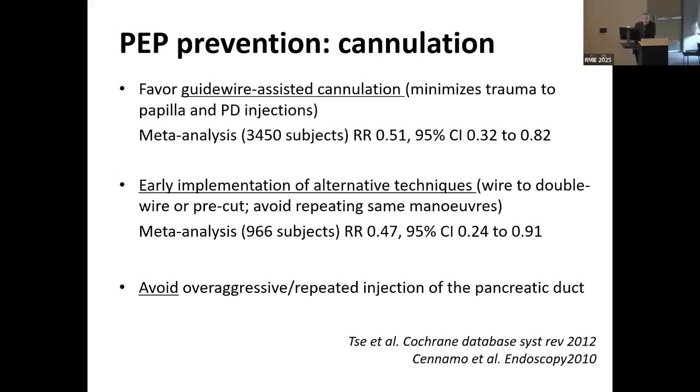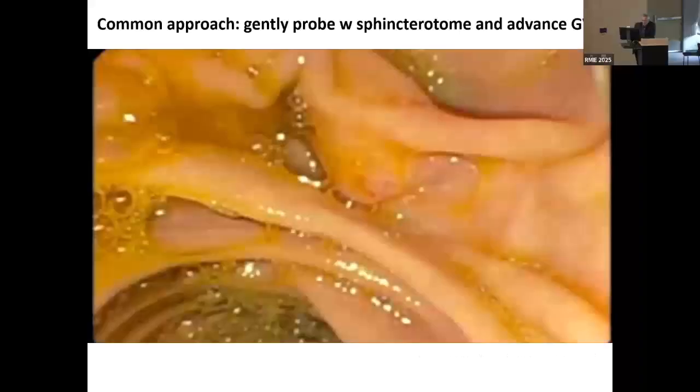And finally, avoid, as we mentioned, over-aggressive repeated injection of the pancreatic duct, although the occasional whiff is actually not a bad thing if you don't know where you are. I'll show you a video for that. And I know one of the speakers had mentioned that during one of the cases.